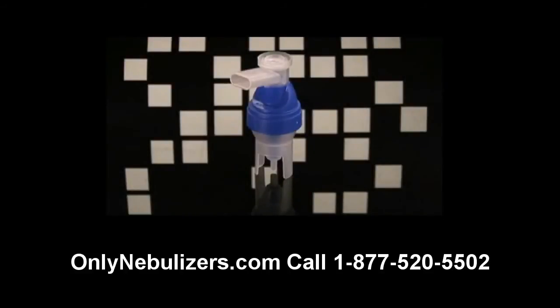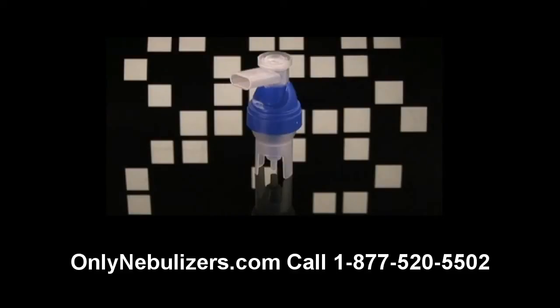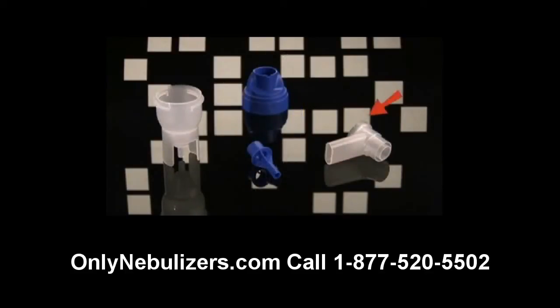You may have received a DeVilbiss reusable nebulizer in addition to a disposable nebulizer with your Traveler. The reusable nebulizer should be used as your primary nebulizer. The disposable nebulizer was provided as a backup should you lose or damage the primary reusable nebulizer. Please note that the reusable nebulizer provided with your unit may look different from this one, and in the future you may receive a nebulizer from your provider that looks different. However, the care and use of most reusable nebulizers is similar. The reusable nebulizer consists of a mouthpiece, cap, medication cup, baffle, and tubing.